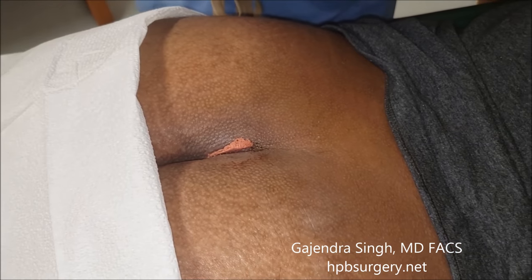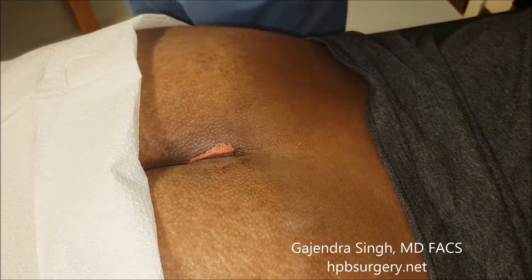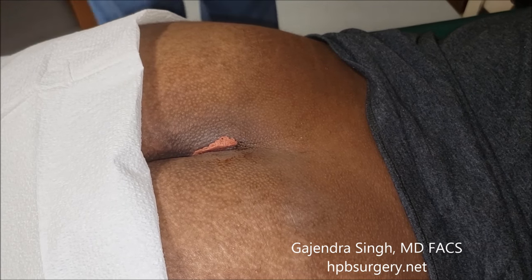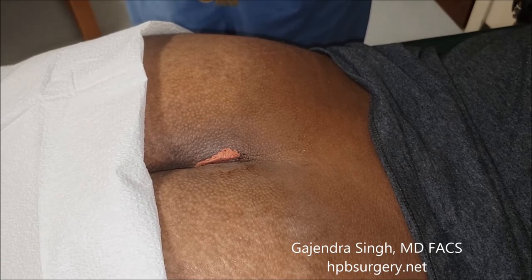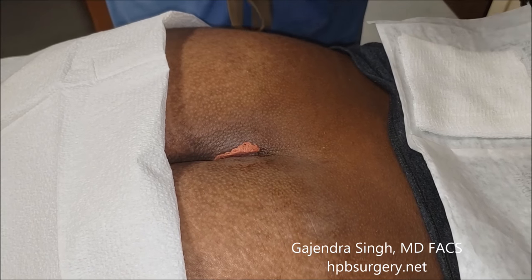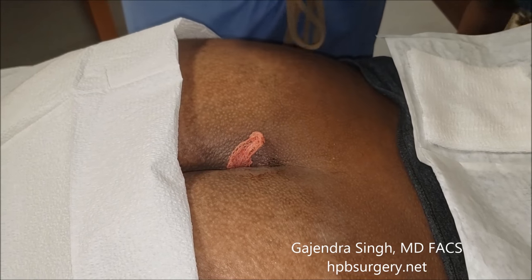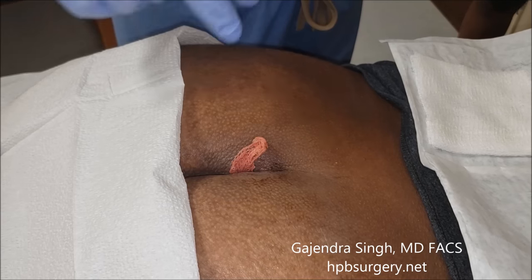The first dressing change is always painful. This abscess was drained just yesterday, so today the patient's mother is here to learn. We're getting ready to start the dressing change. This is a pilonidal abscess that was drained just yesterday, so it's still a little wet. Usually it takes a few days before all the pus goes away with antibiotics. It's a little painful because I packed it really tight at the time of surgery — this is a four-by-four packing from yesterday.